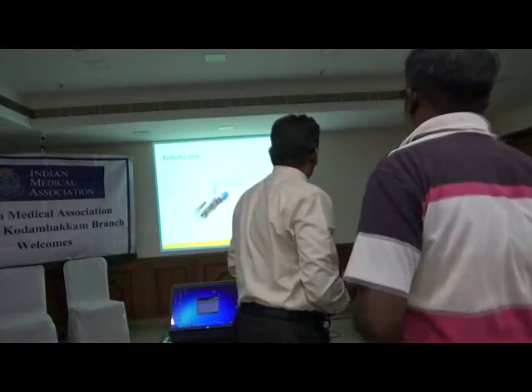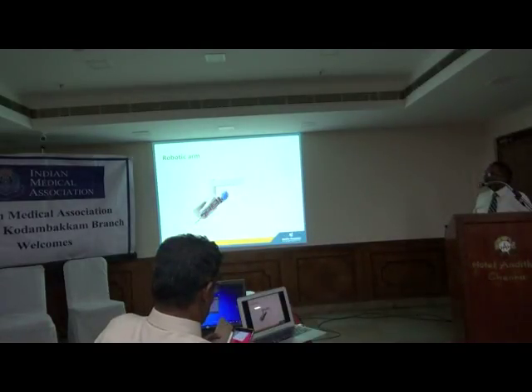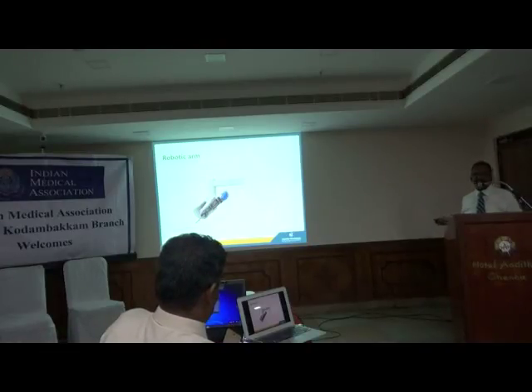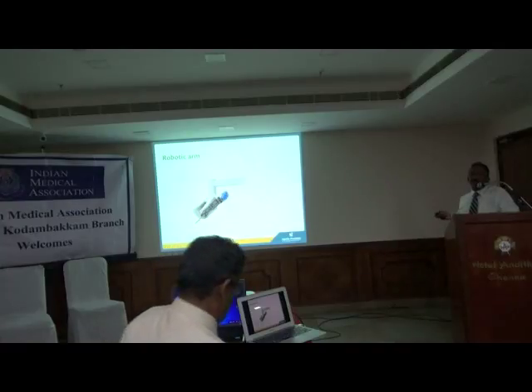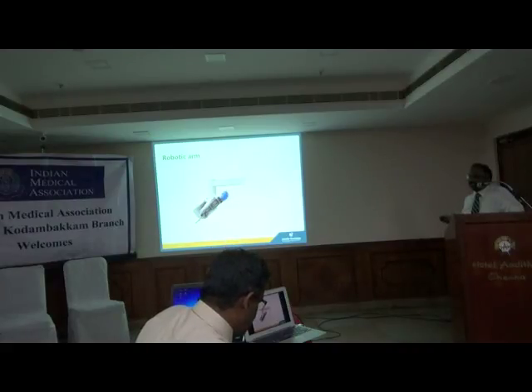Oh, sorry. You see, this is an instrument. This is what makes the robot very costly. Basically, this is disposable. The one who invented the robot is a very clever guy. What they did is they made this one disposable, so it can be used only for 10 cases. After that, the computer won't recognize it. So basically, that's where they make the money. It's a recurring cost.